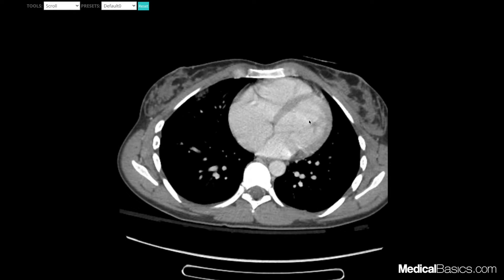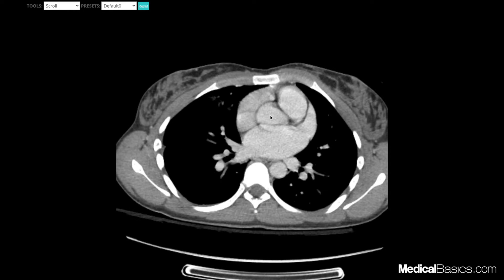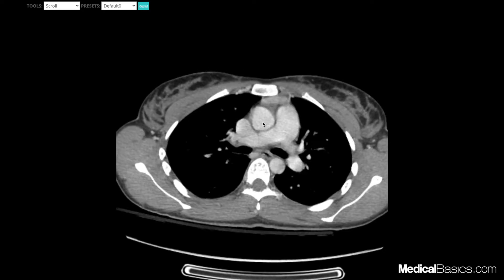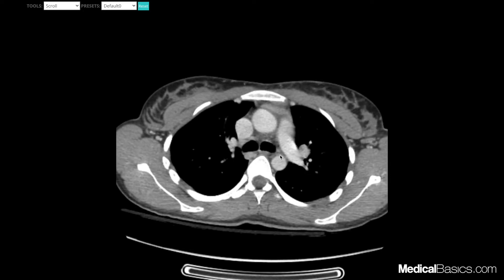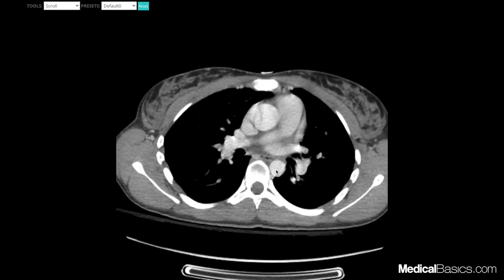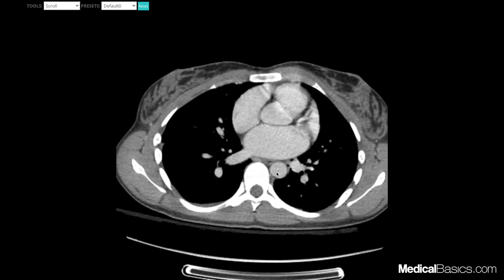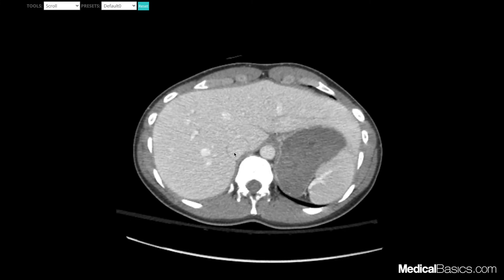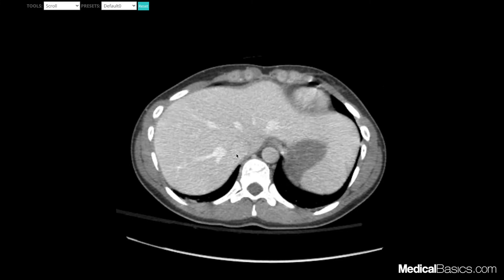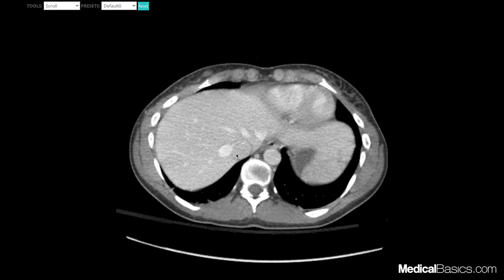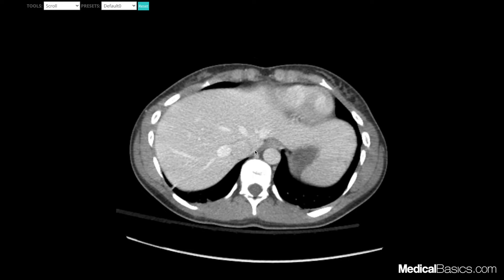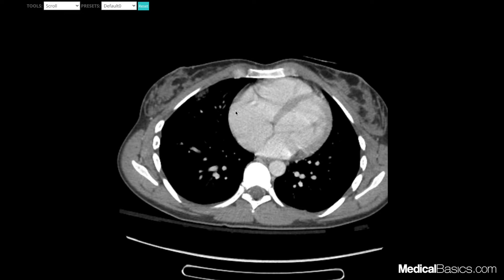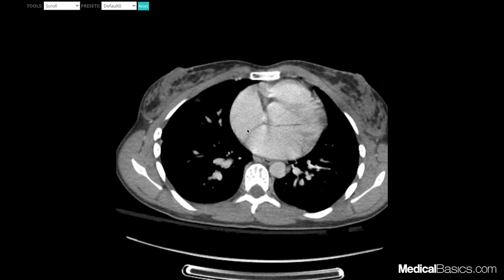If we follow the left ventricle, it dumps into the aorta — so this is our ascending aorta, our aortic arch going down to the descending aorta and eventually into the abdominal aorta. This is going to be our IVC coming from below with our hepatic veins draining into it, and the IVC will eventually go into our right atrium.